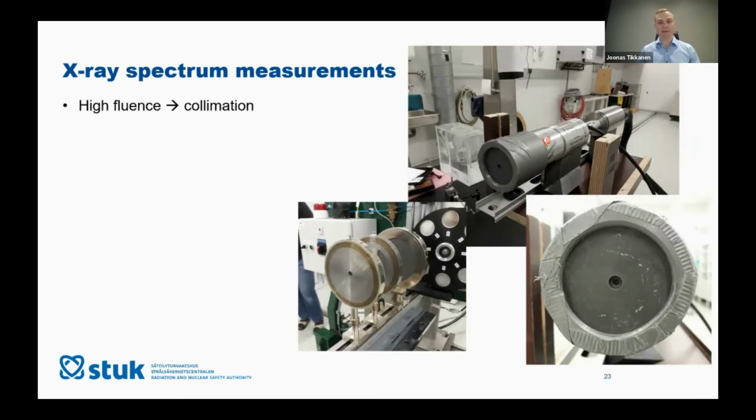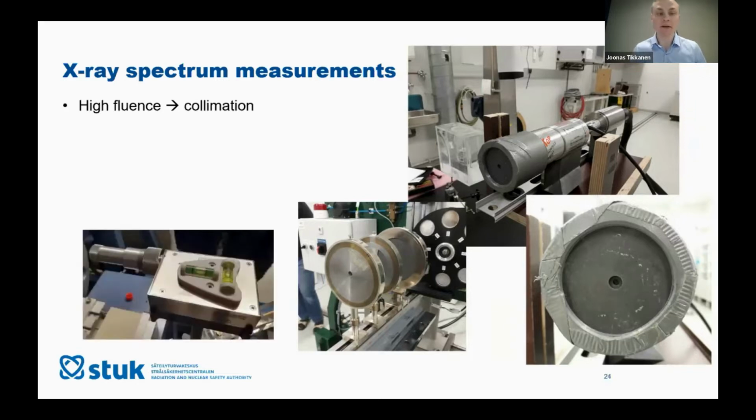But now, when we have measured our spectra, here you can also see a cadmium telluride detector with a collimation setup in front of the detector part.